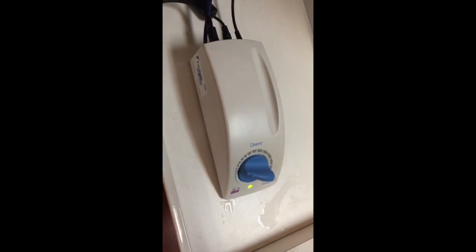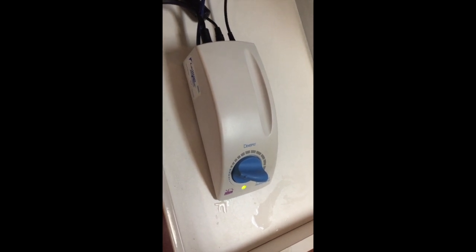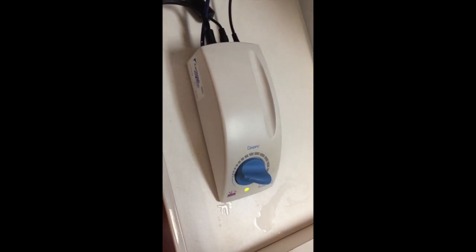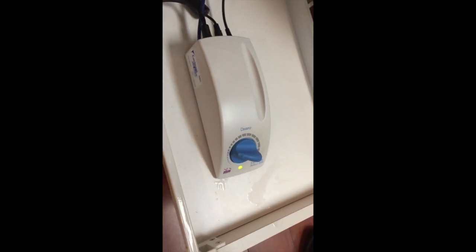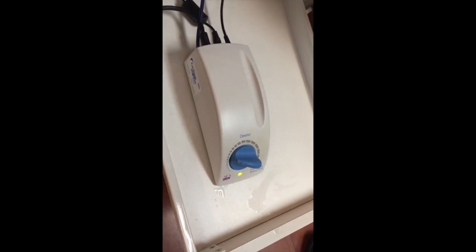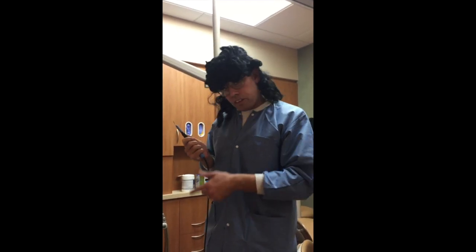You gotta listen to the unit to see whether it makes a click when you step on the pedal. If it works, it sounds like this. If the unit's not clicking, it could be two things: one is the hose that we already described, and two could be the water valve solenoid. So first, you gotta rule out the cord that we just troubleshot. If the cable is bad, you will not hear the click of the solenoid. But if the cable's good and you still don't hear the click, it means the water valve solenoid is bad.